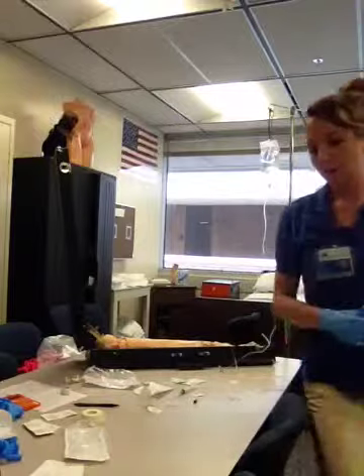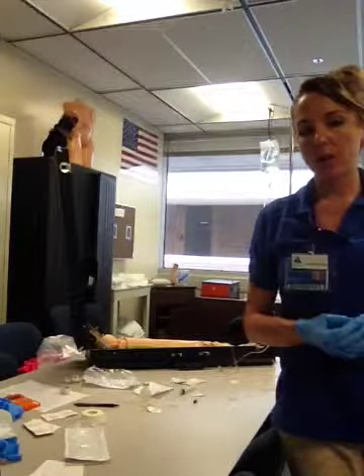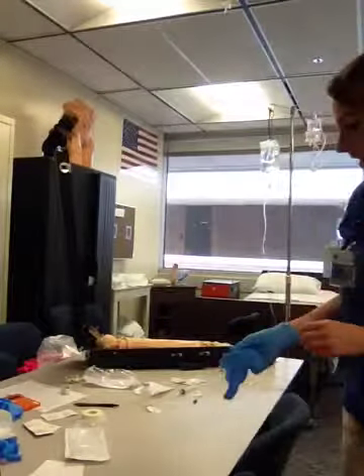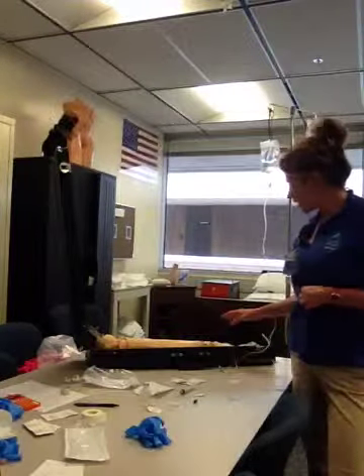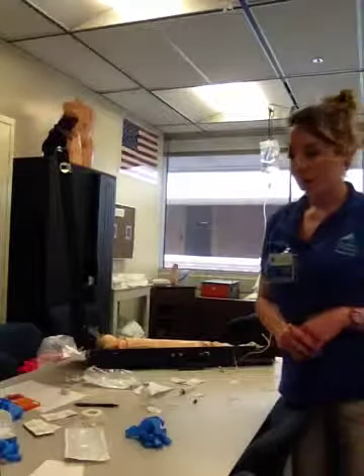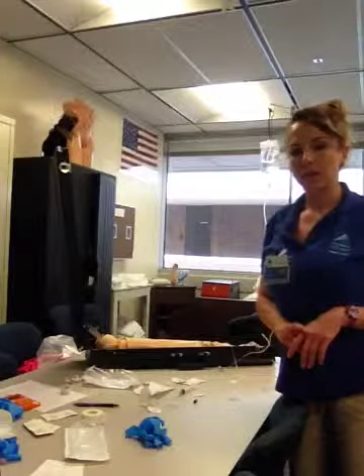Once I am done, I'm going to document in the MAR the drug that was given, the time, the date, the drug, the dose, the route, and I'm also going to state that the condition of the IV site was good. I'm going to record how much was infused from the piggyback bag into the patient's input and output.